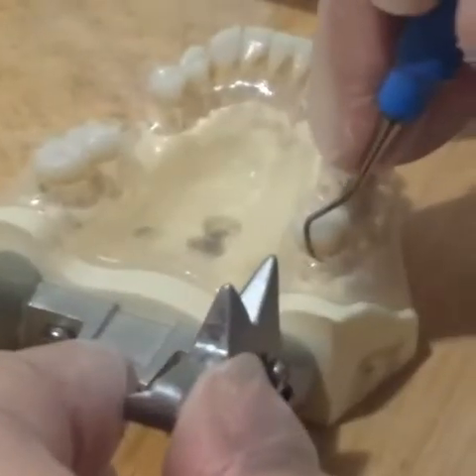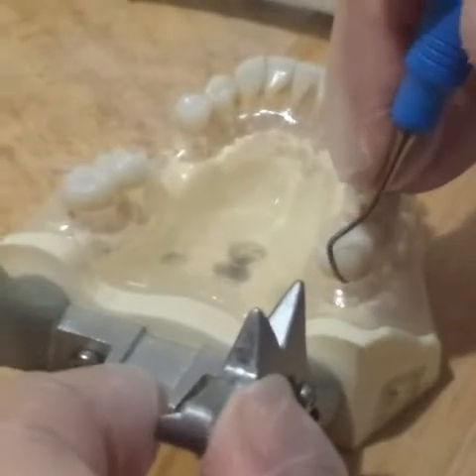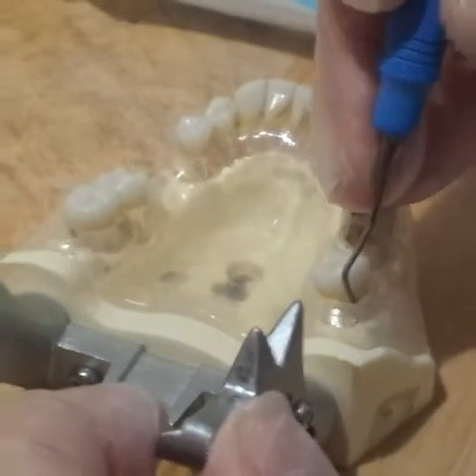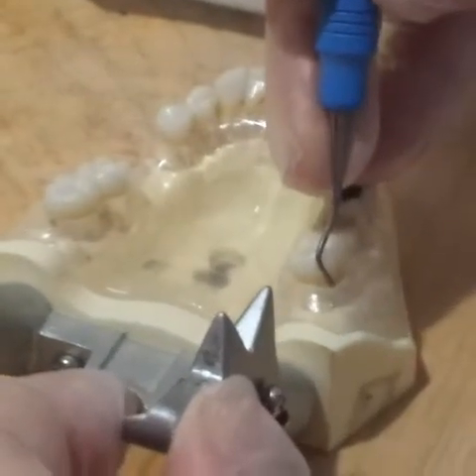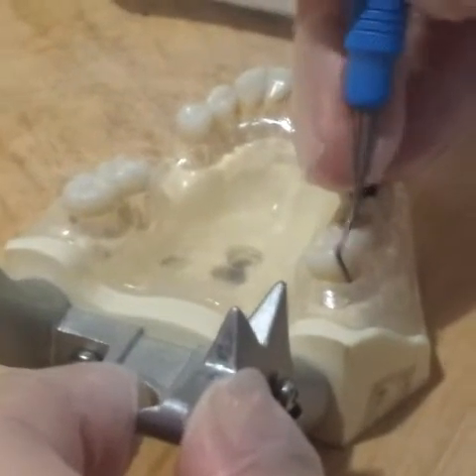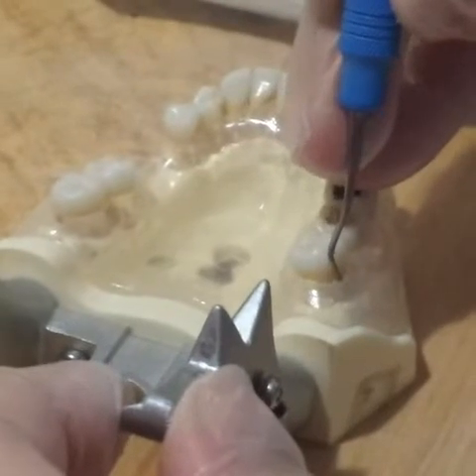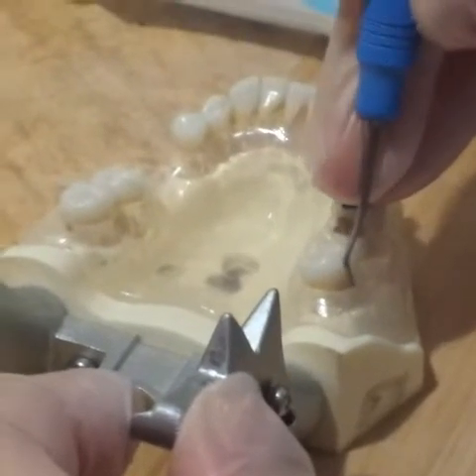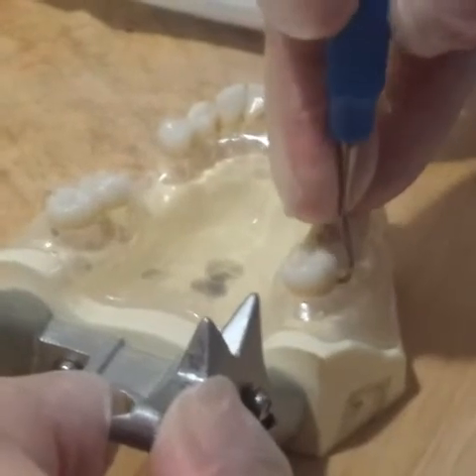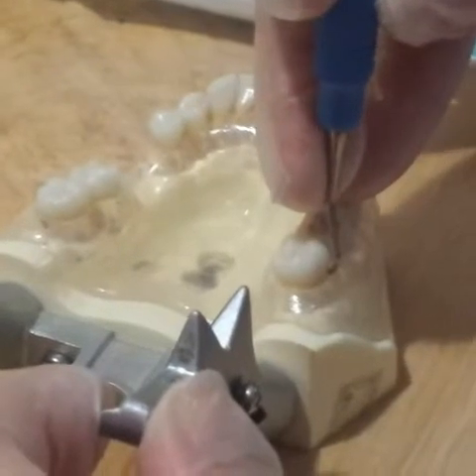Still using an assessment stroke, move your instrument back to the distal line angle and roll the toe inward towards the tooth until the instrument toe is pointed mesially. Continue the assessment stroke along the buccal surface of the tooth and into the mesial interproximal area, going slightly lingual to the direct mesial.